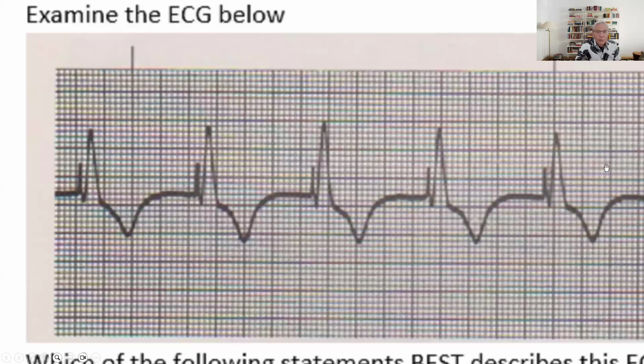Atrial, ventricular, or dual? What follows the spike? It's easy. Is it a P wave or QRS? The QRS. Yes. So if QRS follows the spike, what type of pacemaker is it? It's a ventricular pacemaker. Okay? So this is a ventricular pacemaker.